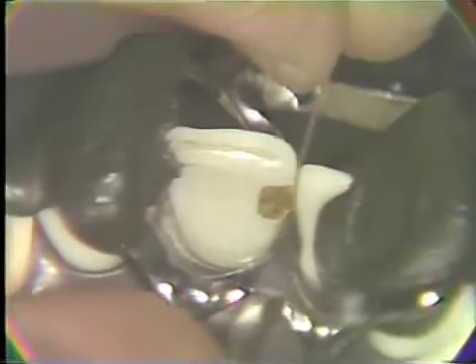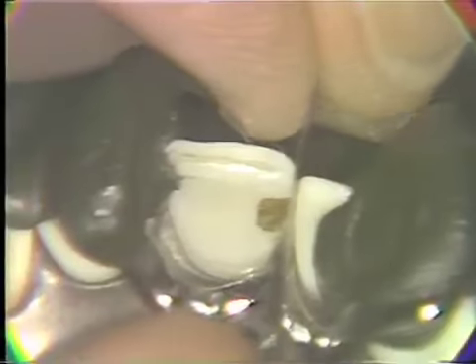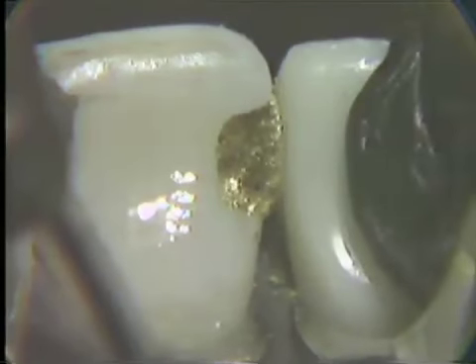Contact is in excess because of the separation that we've gained both with our wedge initially and with the condensation force that we've applied. We're protecting, of course, gingival tissue here with the separator. We begin to establish a bit of the contour on the marginal ridge area. Once this is completed, now with this contact area open, we'll carry on with the finer disc and then move into the completion of the restoration.